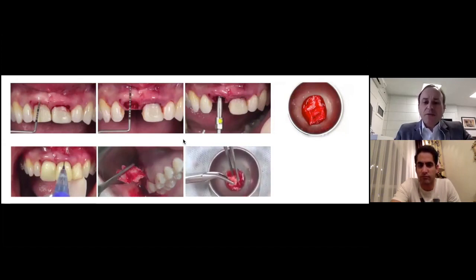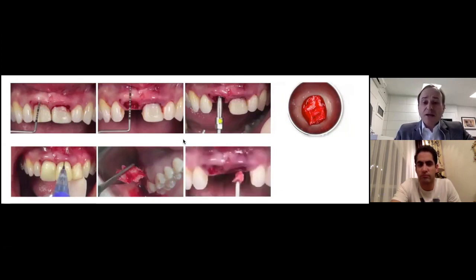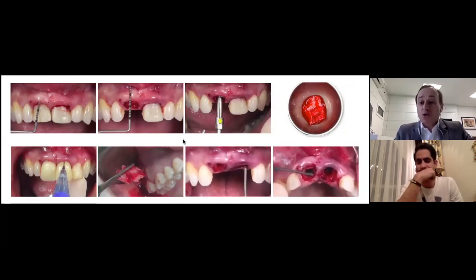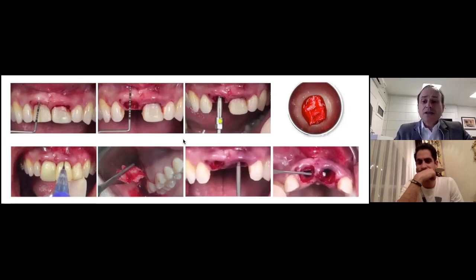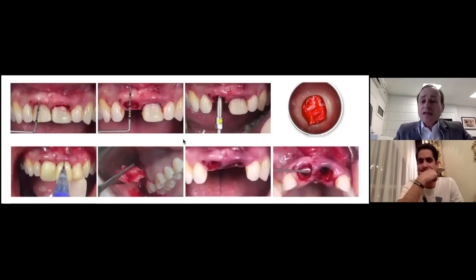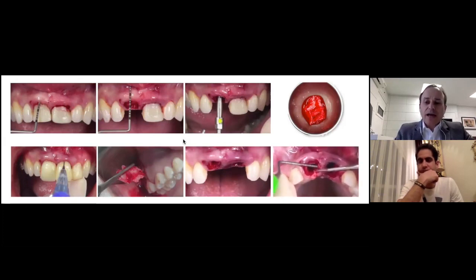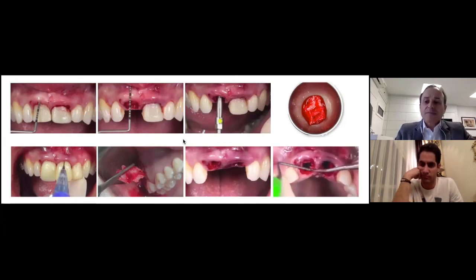And we crushed the remaining bone using a grinder, as you can see right here, in order to reduce the size of the particles. And we packed this particulate bone in order to fully fill these gaps. But it was missing to restore the crestal bone between these two implants. This is why we are making here, underneath the papilla, a very careful incision. And we did the curettage, we removed the granulation tissue, and we packed bone particles, just small particles, using a bone compactor, as you can see here. This bone compactor is part of the IDR kit, made of titanium.